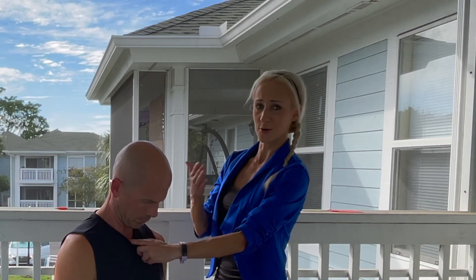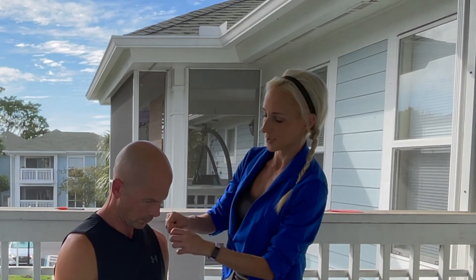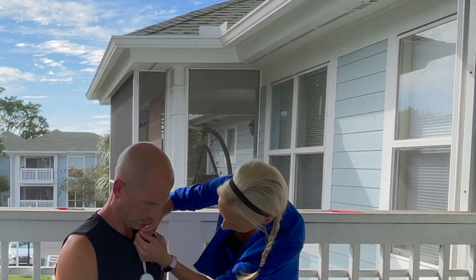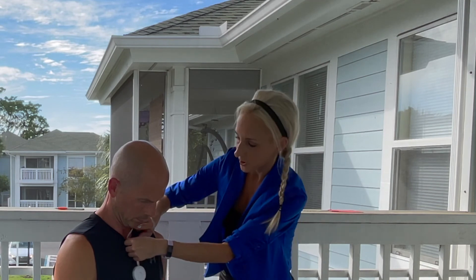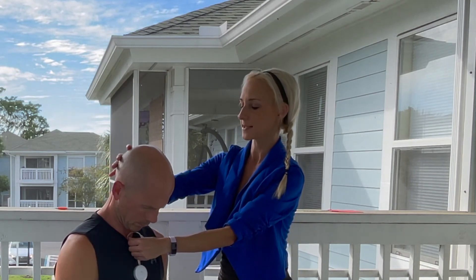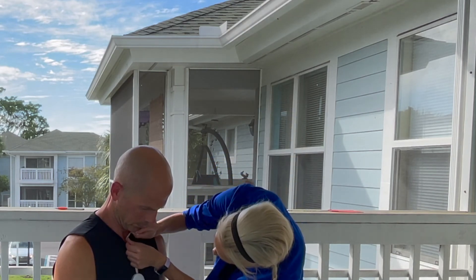Measure from the actual chin — not skin, not beard, the actual bone. If there really is no space, you don't need to measure, but most of the time when you're measuring this on patients there's a deficit and that's why you're measuring. Base of the chin to the manubrium — you have four centimeters. If your patient is able to tolerate it and they're cleared for passive range, you can measure that as well: two centimeters.